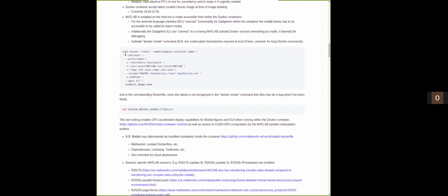So there's the use for host networking from a container. Basically Docker wants to isolate what you're running in the container from the real world, but to some extent we want to subvert that and really allow access to what's necessary from the rest of the world into the container, including MATLAB. Privileged is to do with being allowed to mount within the container. It's not so important here.